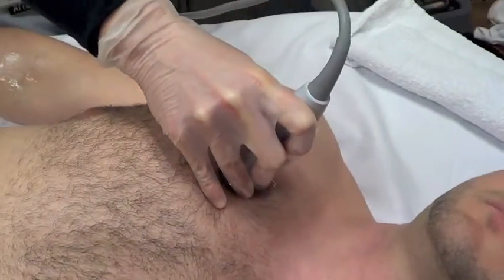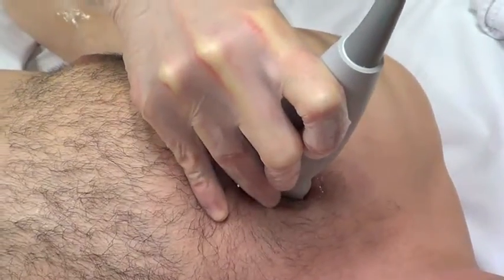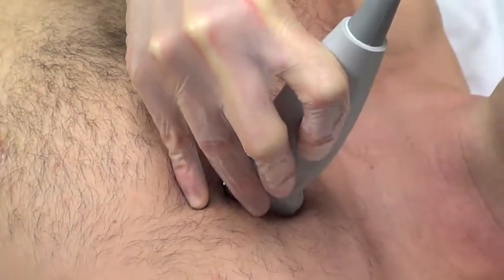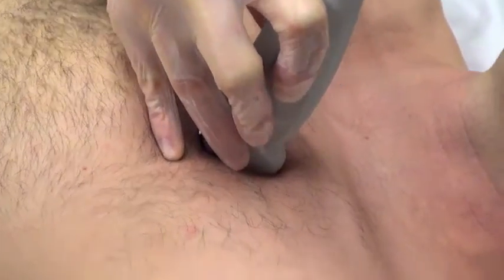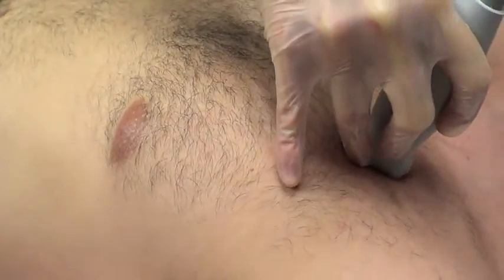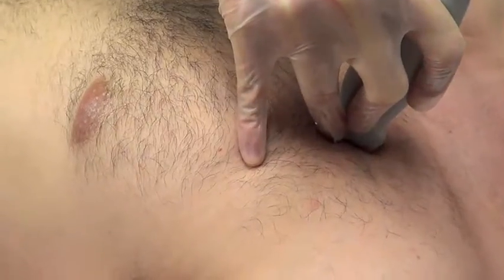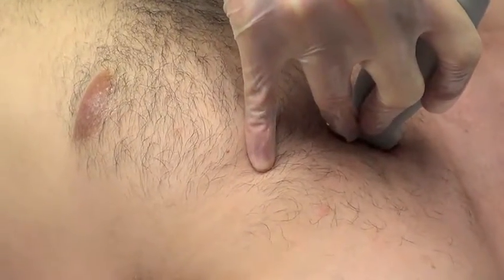If we look here on our trauma patients and we don't see a pneumothorax, then we stop and do the same thing on the other side. You want to make sure you hold the probe very still and are not shaking it around, because you don't want to cause an artifact on the M-mode. On this side you have the patient's heart, which is going to be beating, and that's going to cause motion artifact as well — so you want to make sure you're not getting anything confused with that.